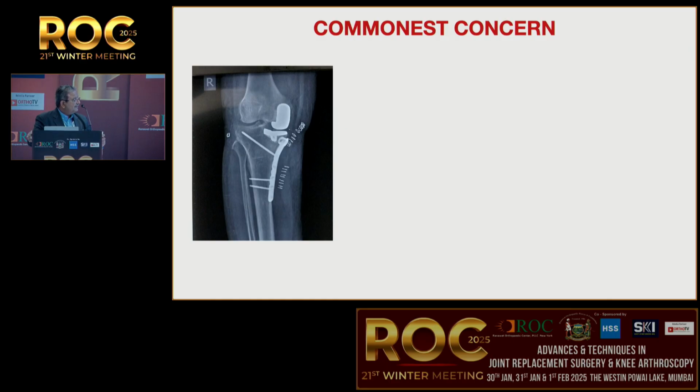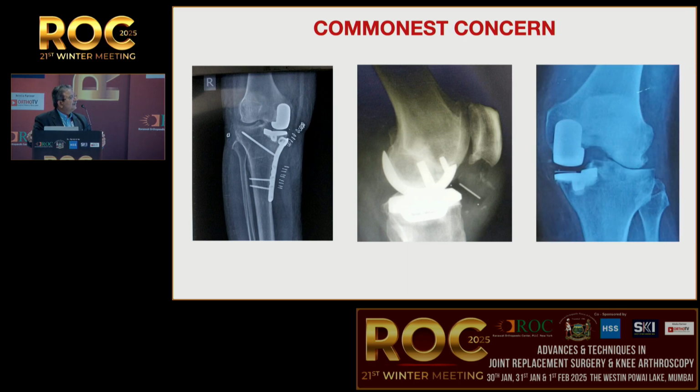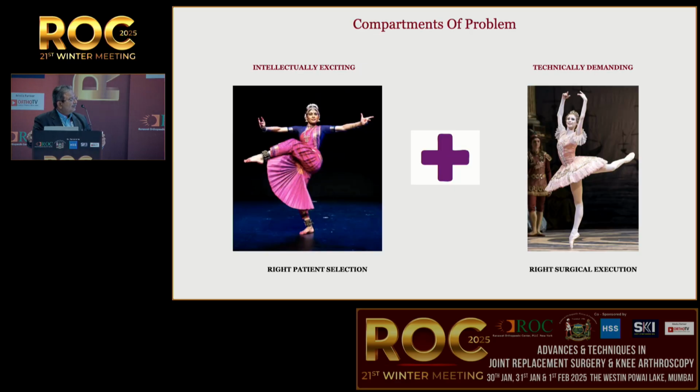Still, the commonest concerns, very common, these are our own cases of tibial condyle fracture, bearing dislocation can happen, and overcorrection due to over-release on the medial side with progression of disease. These are the commonest concerns if you do not pay attention.